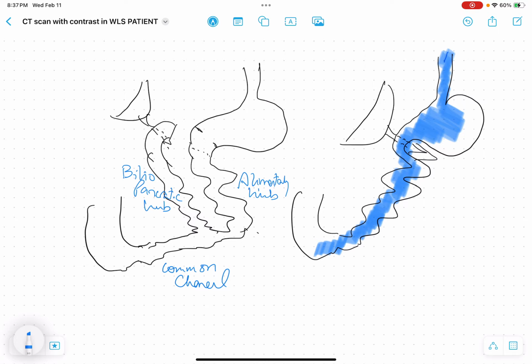from stomach into the colon. Now, in a duodenal switch patient, and I want to make the point that this is for the real duodenal switch, and not the SADI or the SIPS, because that's a different anatomy with different physiology. I didn't draw the variation on the stomach here, but let's follow the contrast. What happens when a patient drinks contrast with a CT scan with gastrografin contrast?